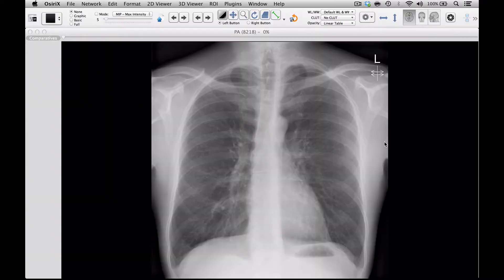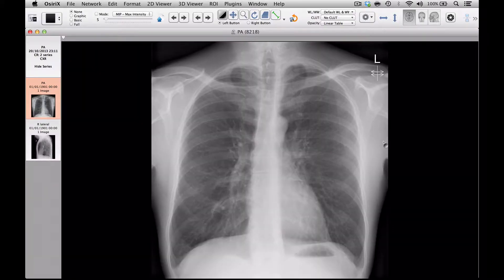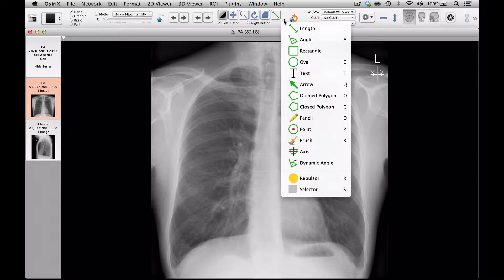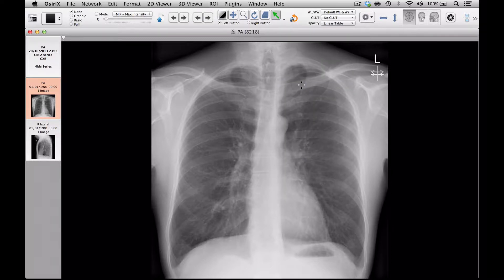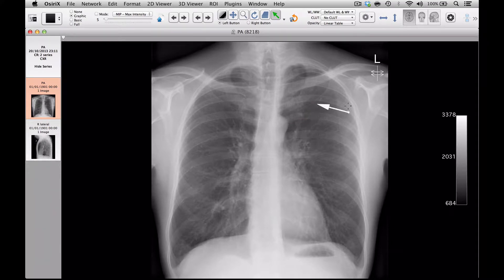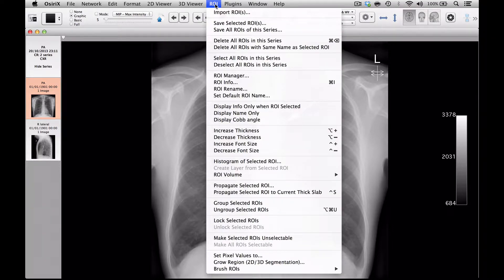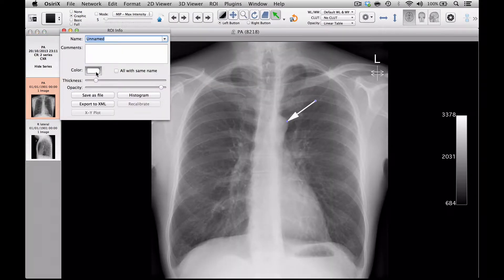The first thing I'll do is open up the chest radiograph, and within OSIRIX, if you look in the top menu, you'll find the ROI screen will give you a list of menu options including the option to arrow a structure on the image. So if I decide to arrow the aortic arch, I make an arrow and point it at the aortic arch. I've got a point where I can change the colour or the thickness of the arrow. If I go into the ROI menu bar and look at ROI information, I have the option to change the colour, the thickness, or the opacity of the arrow.